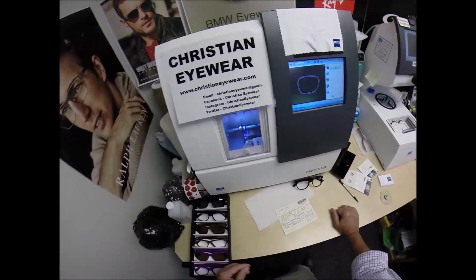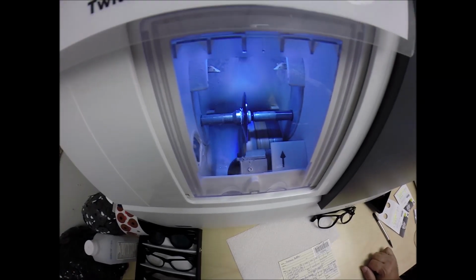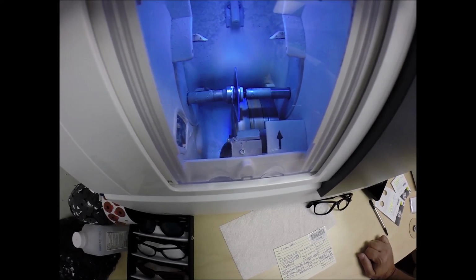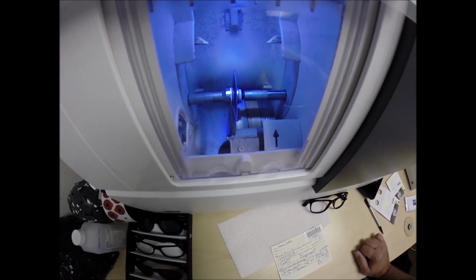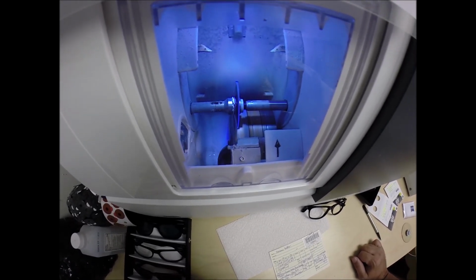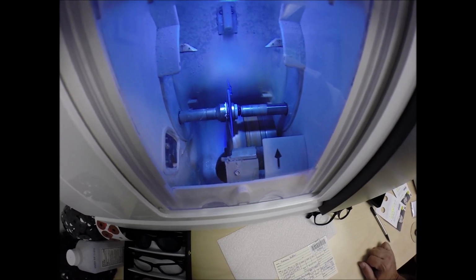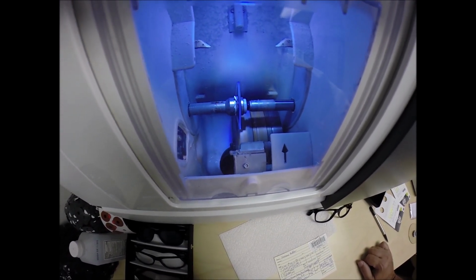Now, the water that's in the background causing the light to flicker, that's there to catch the optical sawdust. Polycarbonate lenses cut dry, meaning that no water sprays onto the lens while it is cutting. Unlike plastic, high-index plastic, and Trivex, which is a different lens material, water sprays on those lenses continuously. Now, water will spray onto this lens, but only for the last 20 seconds to wash away the optical debris that you see beginning to form on the edge of the lens.